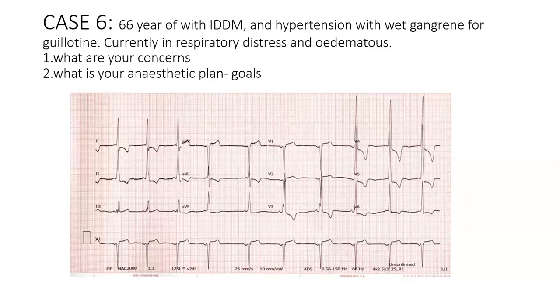One minute, look at that ECG and tell me in point form what would be your anesthetic concerns and how would you anesthetize this patient.